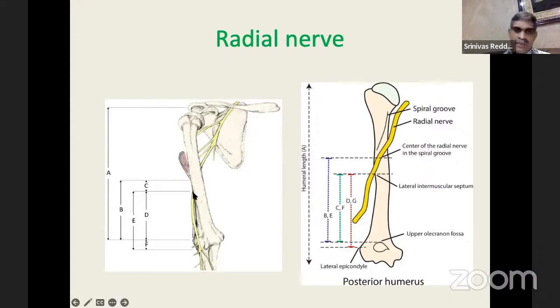Where this exits, we can't say exactly, it differs with the length of the humerus. So the best part is, if we want to have a safe procedure, the advised thing is mini open dissection for the shank pin application. And for the wires, we can go based on the anatomy. We need not open for the wires. For the shank pins, mini open dissection is always advised, and under direct vision it is better to pass them, so as to have a safer application of the pins.